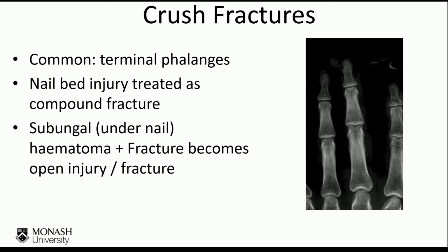Crush fractures are common with the terminal phalanges. The nail bed injury is normally treated as a compound fracture. So subungual, which means under the nail, if there's a hematoma plus a fracture, it then becomes an open fracture.